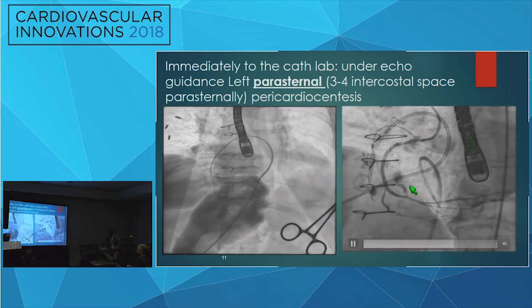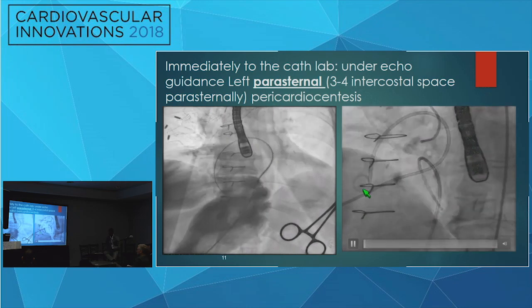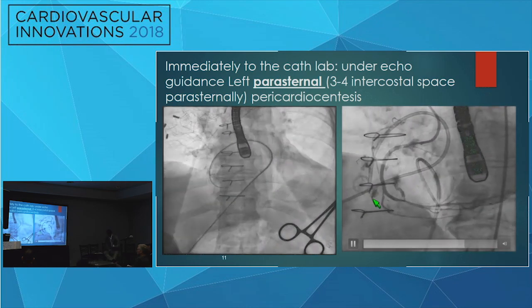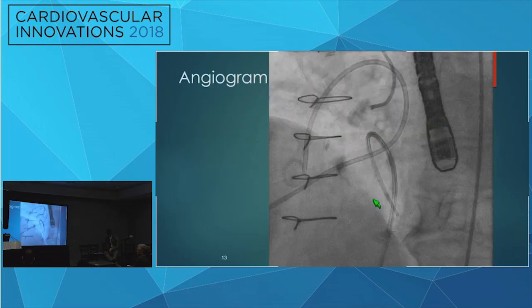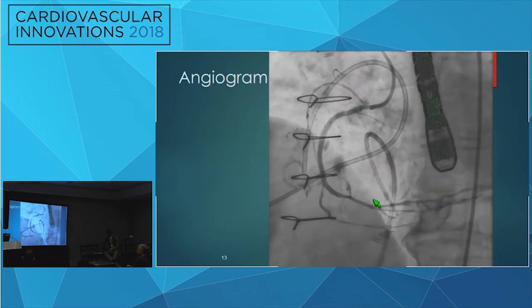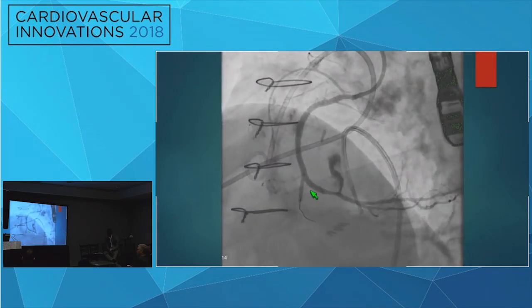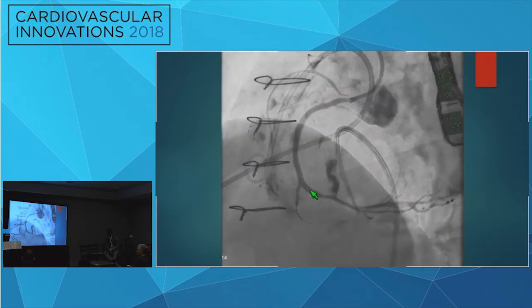Yeah. So this is like the normal graft flow, but this is where you notice something. You see a myocardial blush, you see some pulsatile flow right there. So this is obviously a perforation that happened. And this is the angiogram, the same thing that I showed you. You can see the perforation there. So obviously we went with the wire.